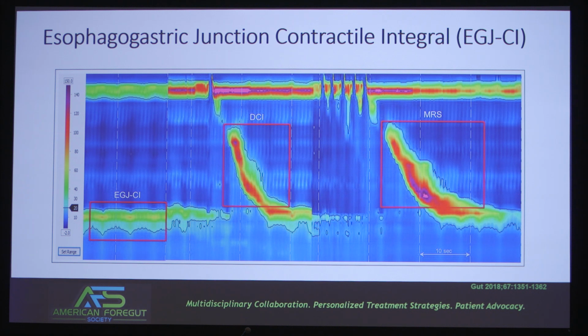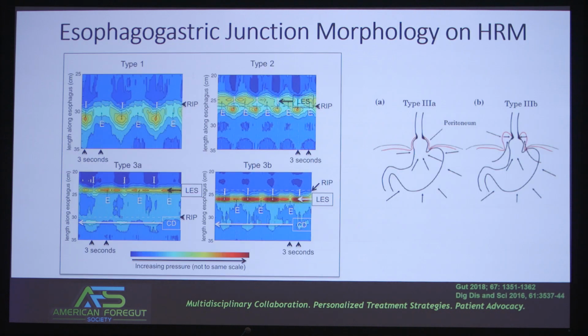That may be a more accurate measurement of the sphincter function. And then there are other concepts like multiple rapid swallows to look at reserve function, and Prakash tells me that patients who can create a strong contraction after multiple rapid swallows will do well with an anti-reflux procedure.